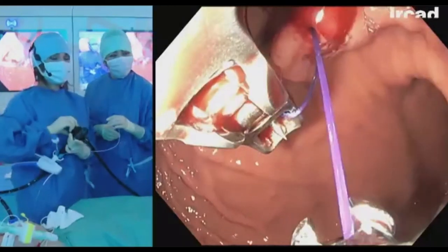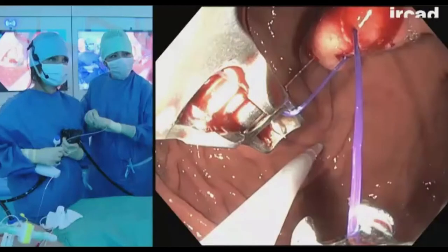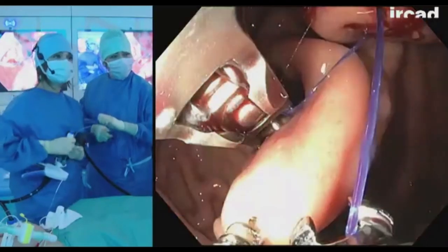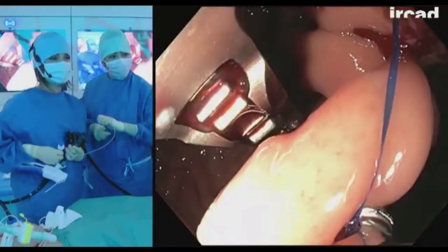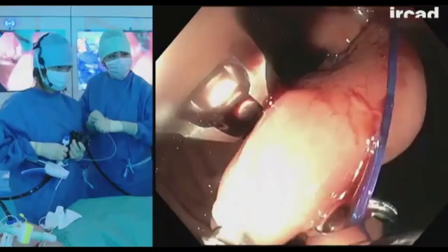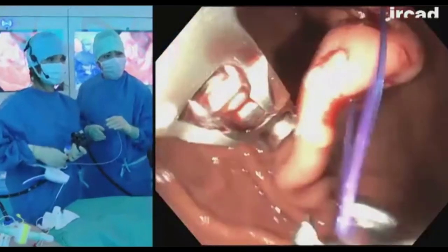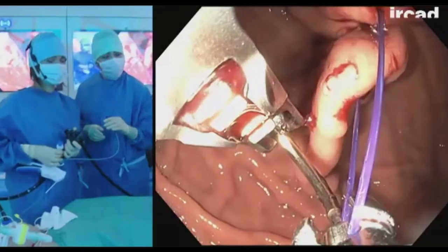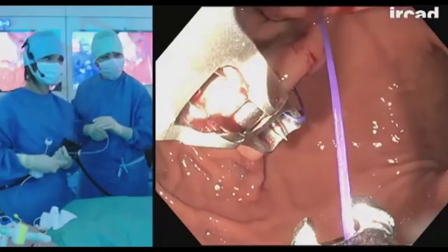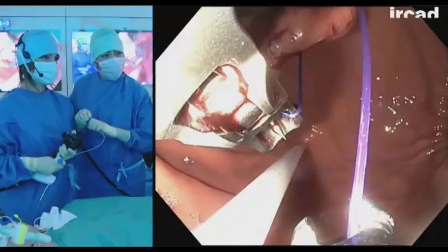So we're going to pursue onto the greater curve, aiming posteriorly, one, two, three. Again, I don't move my scope, it's the tissue that is coming to my scope, and I also pay attention that I am perpendicular to the tissue to have a good grab. Okay, so I keep going.